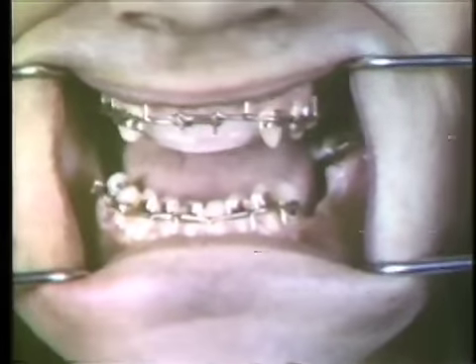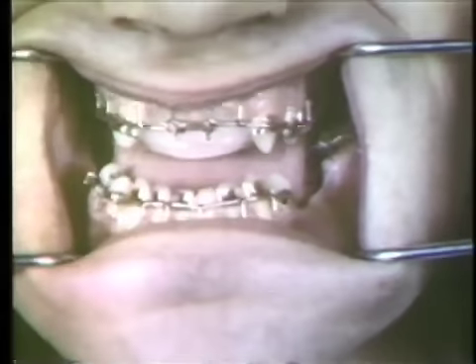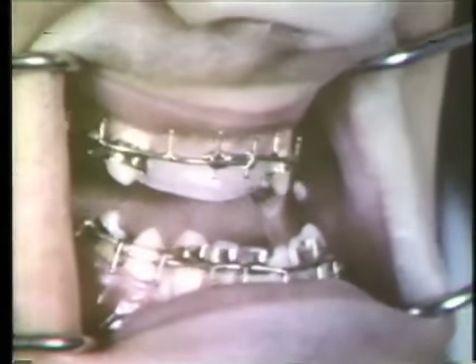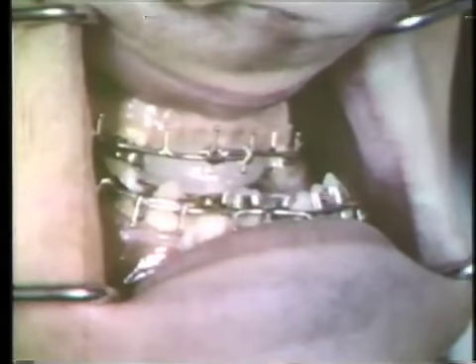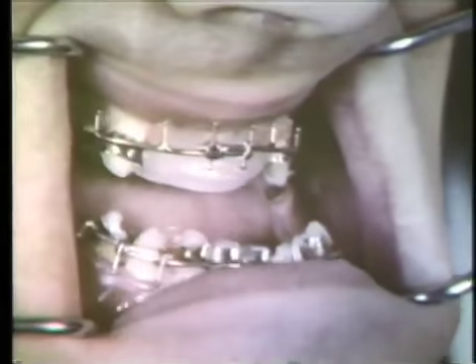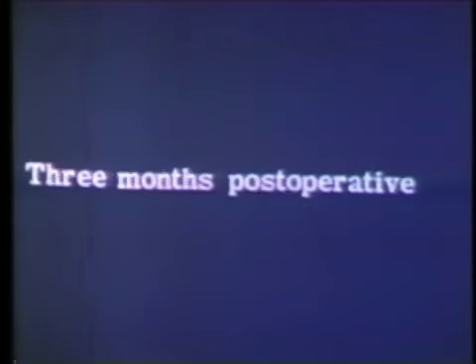Here we see then a splint bite block incorporated for the fixation. Often, if there is a good deal of residual irregularity in the occlusion and some gaps and deficiencies, splints can be utilized to control the jaw during that fixation time.